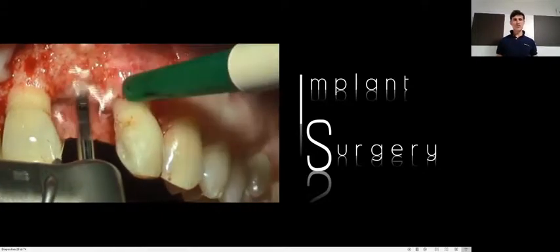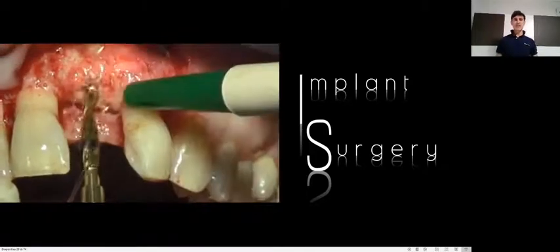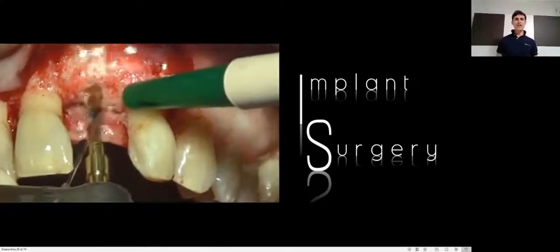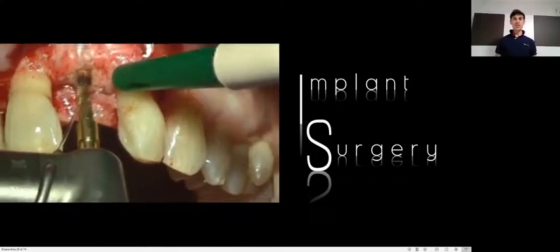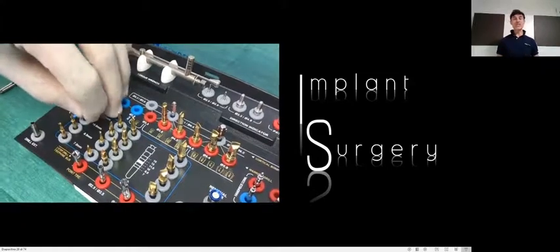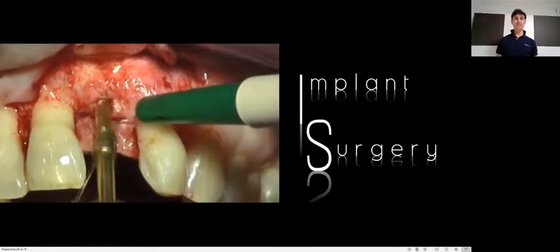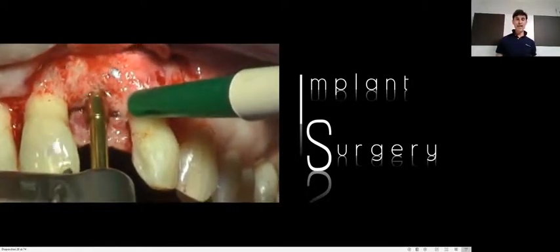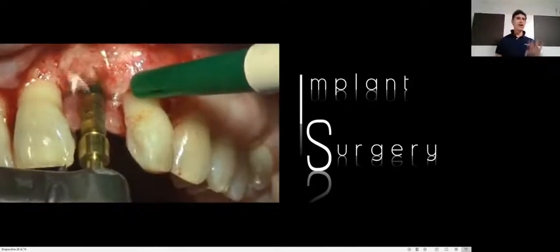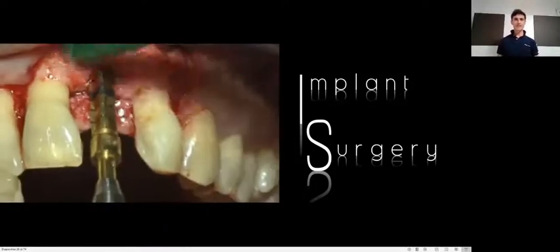No guided surgery was provided in this case, because with the flap elevation we saw perfectly which kind of tissue were available, and we knew the perfect orientation we can choose for this kind of fixture. In this case, we plan to not use the guided surgery. Very helpful in other situations, for example, in post-extraction cases, right?